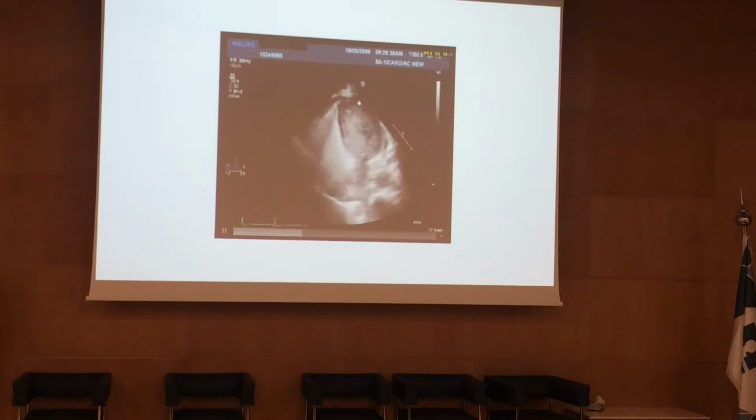So this is the left ventricle, and this is the right ventricle here. Don't worry about these views. I'm not going to ask about them in your exam. I just want to show you the applications of echo. Nobody will ask about this. So here we're injecting contrast and showing the atrial septal defect because of bubbles crossing from the right side to the left side.